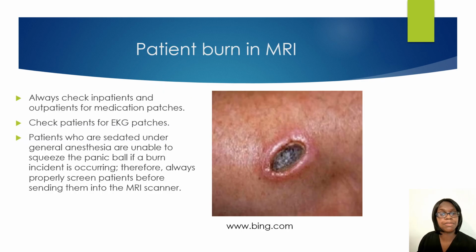Patient burns can happen in MRI, especially if you are not checking the patient's body, making sure that they are removing those EKG patches, those medication patches. You want to make sure that you are properly screening your patients and use that handheld detector to just wand them. Don't be afraid to use the wand. That's what it's there for. You can even just check them just to make sure that they did not forget anything on them as well. So just let the patient know, hey, I'm sorry, but I have to look inside your gown just to make sure there wasn't anything placed on you that cannot go inside of this room.